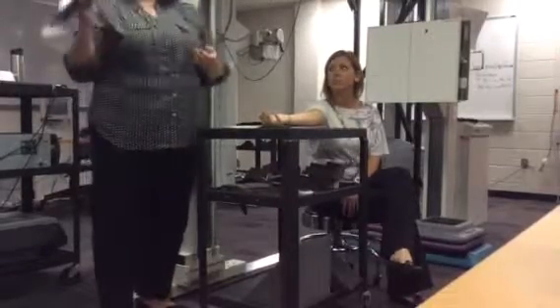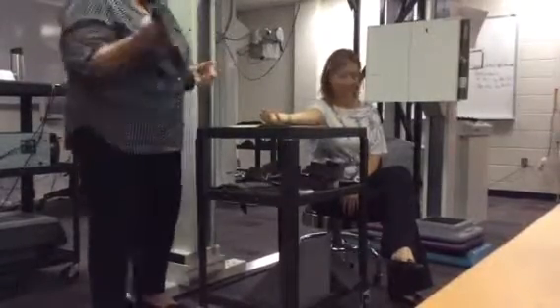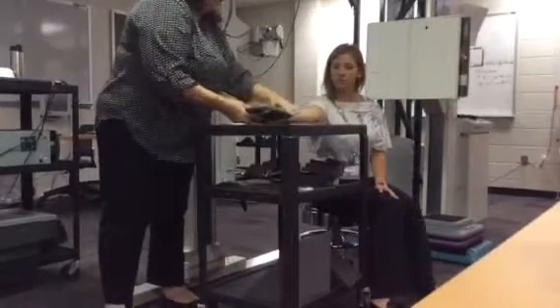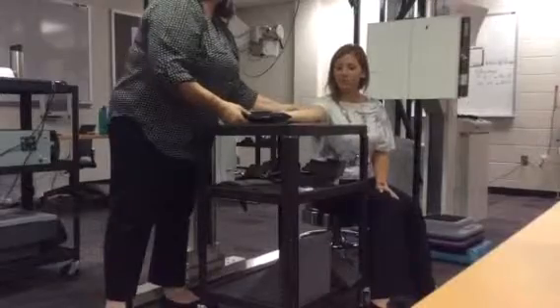I wouldn't use a 10-pound sandbag. That's probably not a good idea. But the 2 pounds is good. So I'm going to put this in the palm of your hand. And that helps your patient to hold that position.